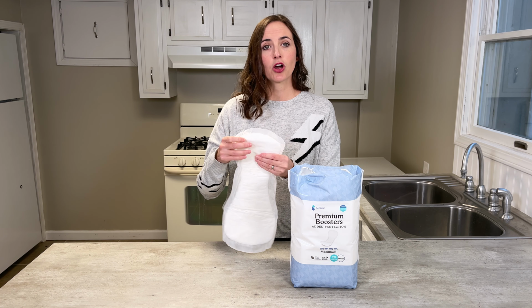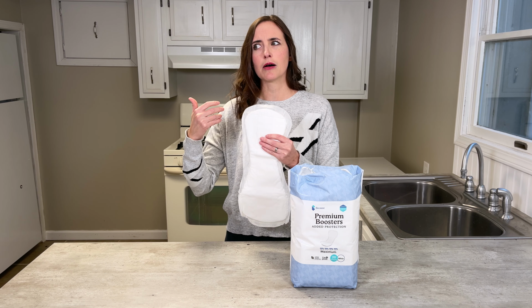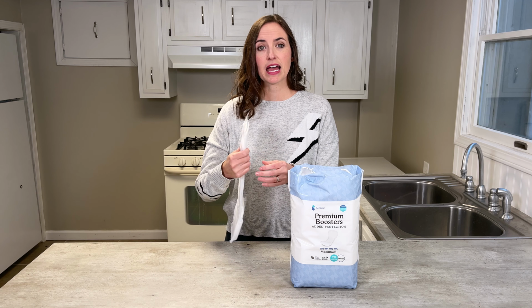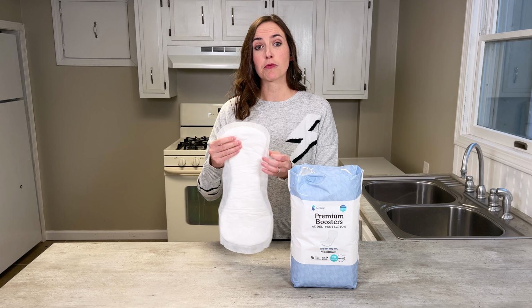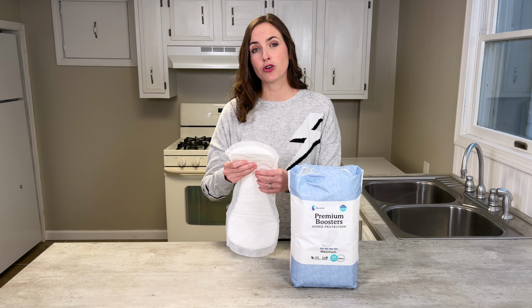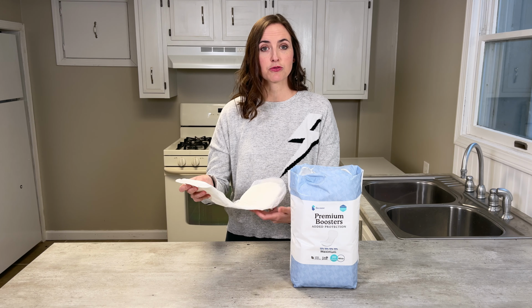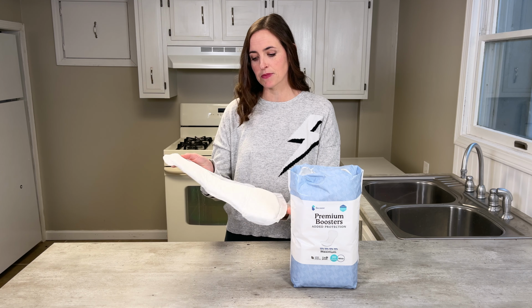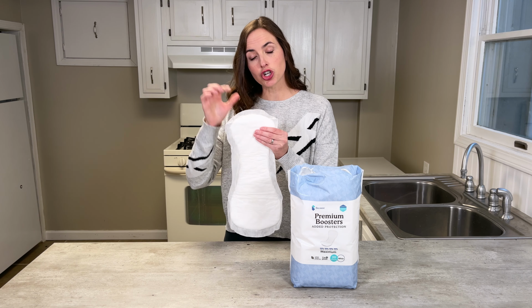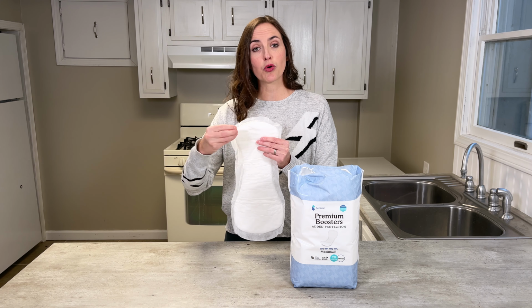The biggest ones I know are when you have an individual who's having frequent or large amounts of urination throughout the day, who maybe is going to be going out for appointments or a travel day. Those are days that are particularly difficult to predict and can be very challenging for getting back to a bathroom to change out a pad brief system. This allows you to change out just the booster when it becomes saturated and leave the actual brief in there.